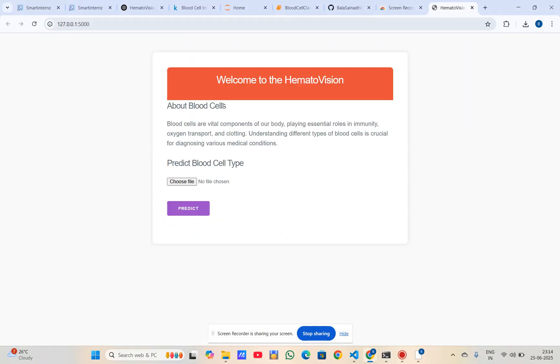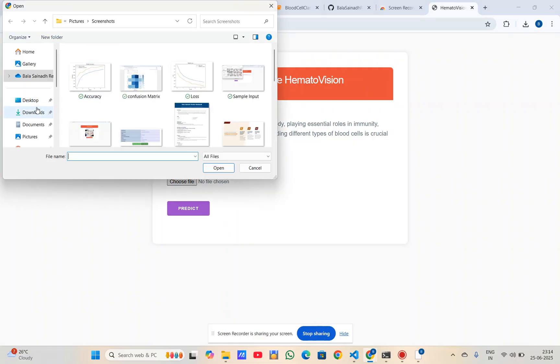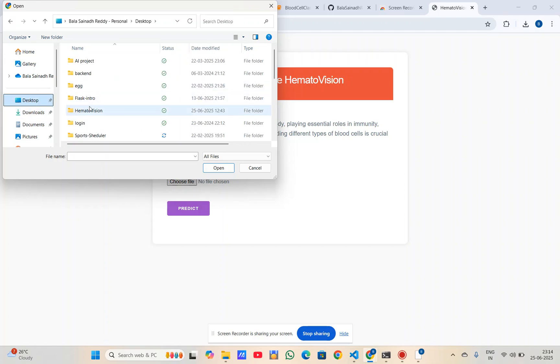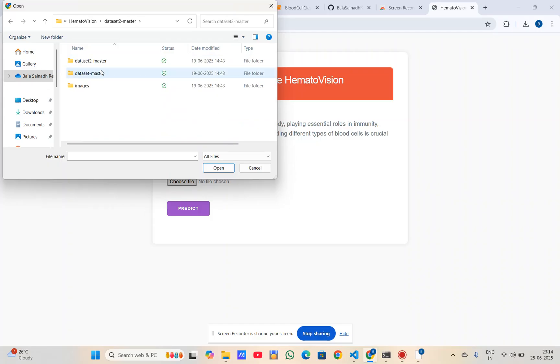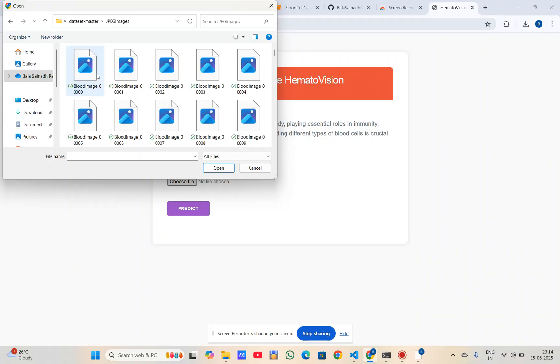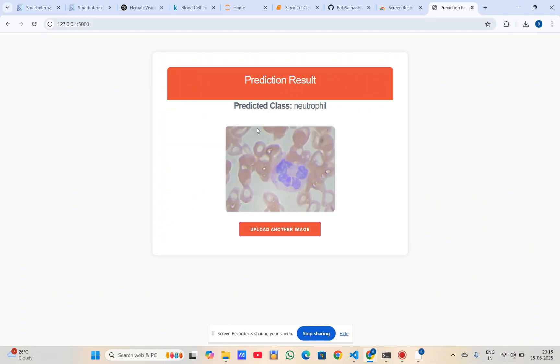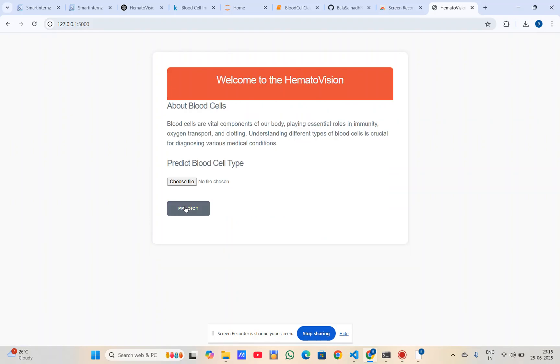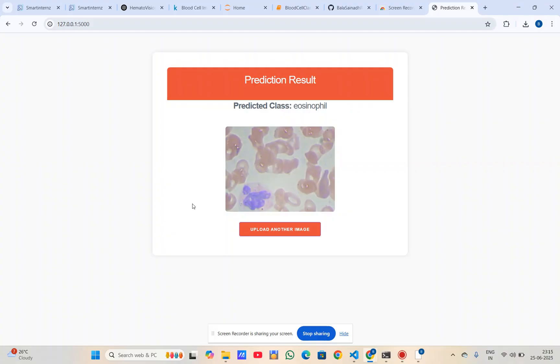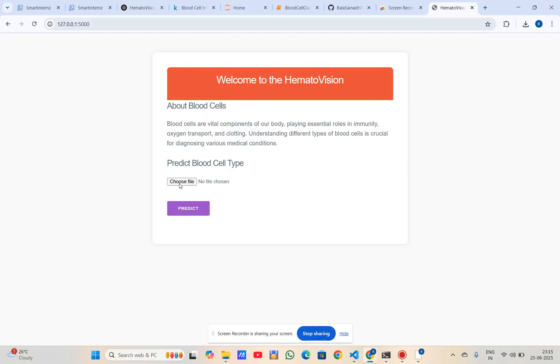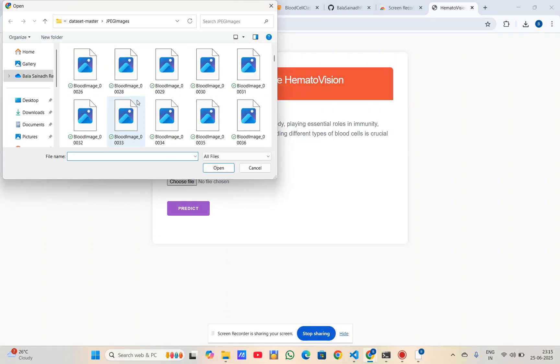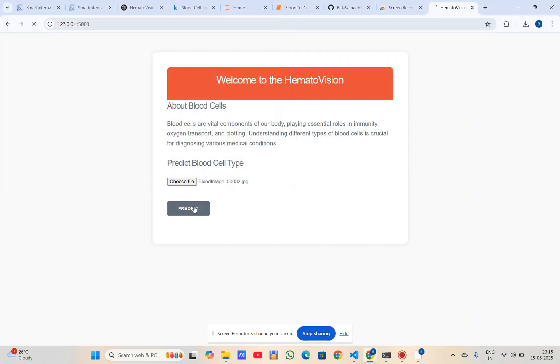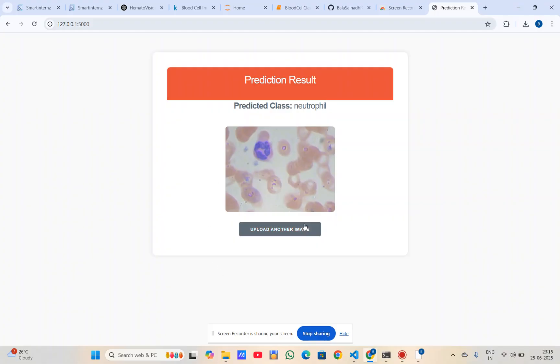This is the home page of our website. Let's choose an image and predict. This is the result page showing the predicted class is neutrophil. We can upload another image and predict again. See, this is also neutrophil. Let's try another class. This is neutrophil as well. This is the main page of our website.